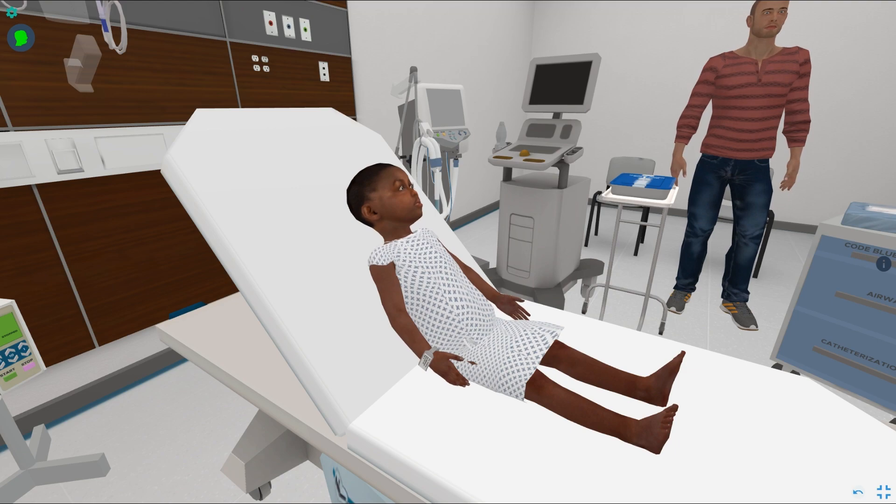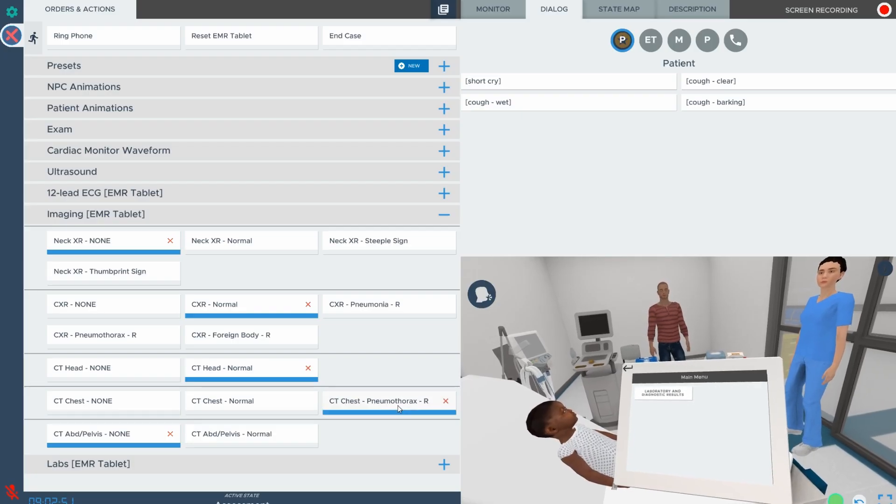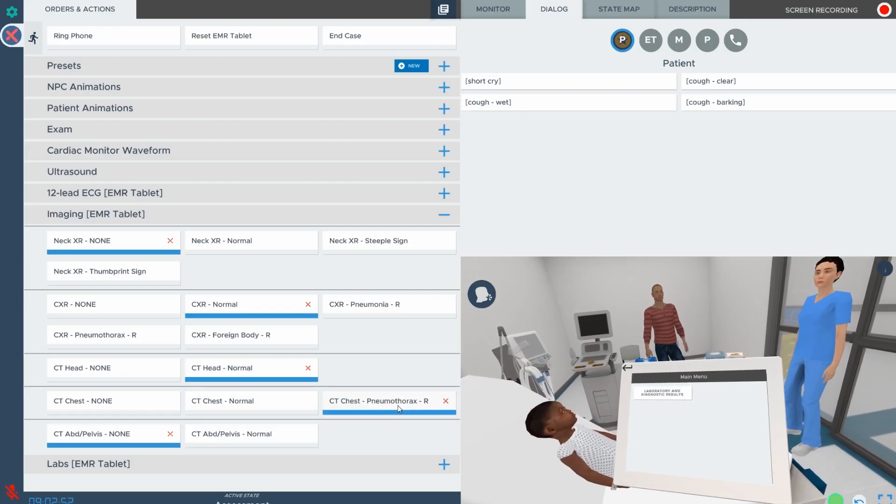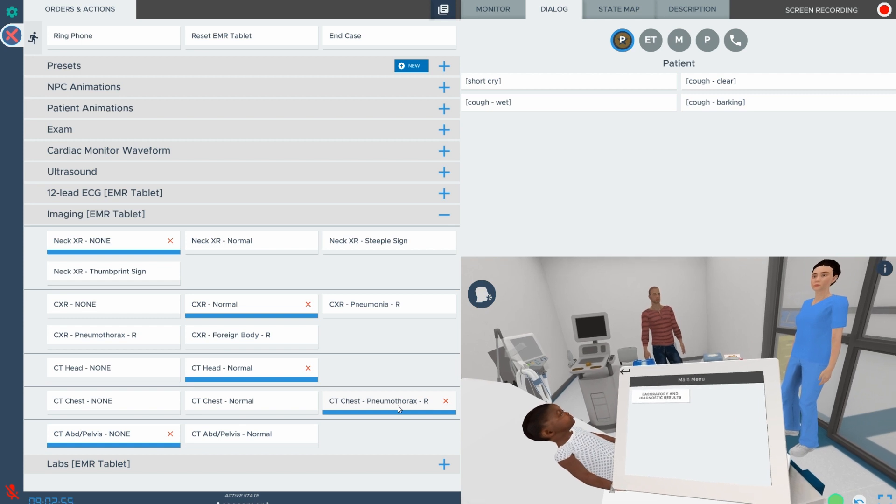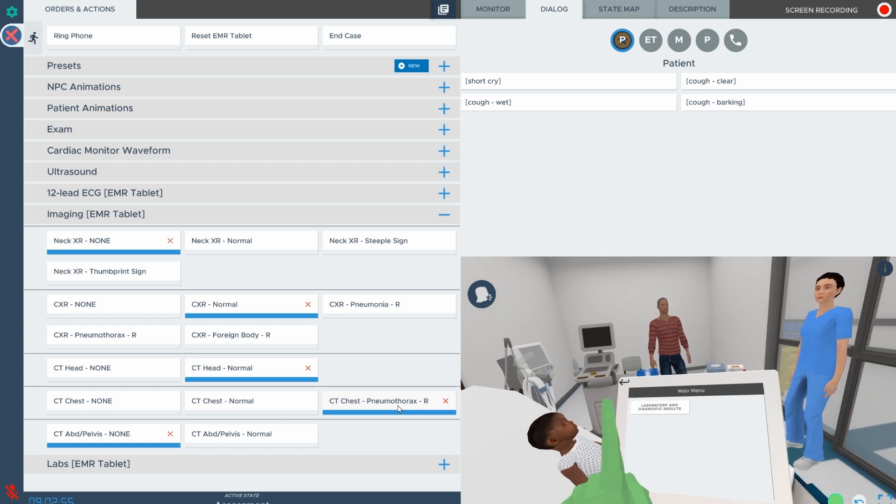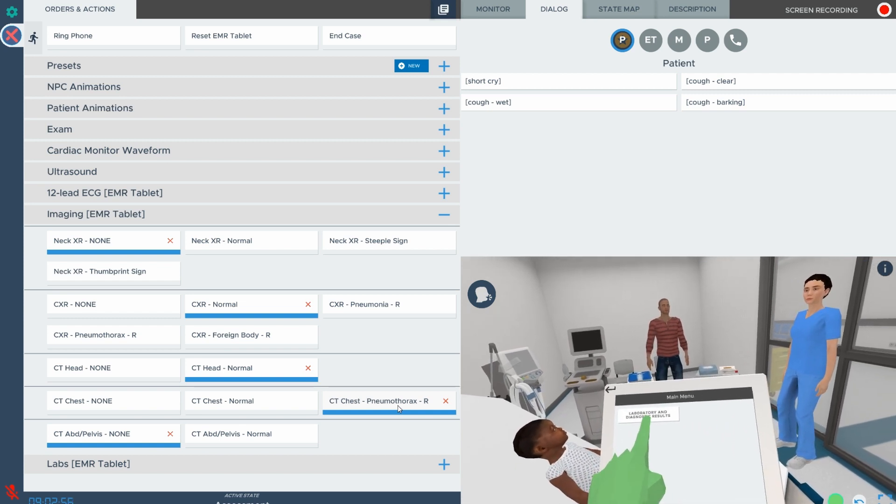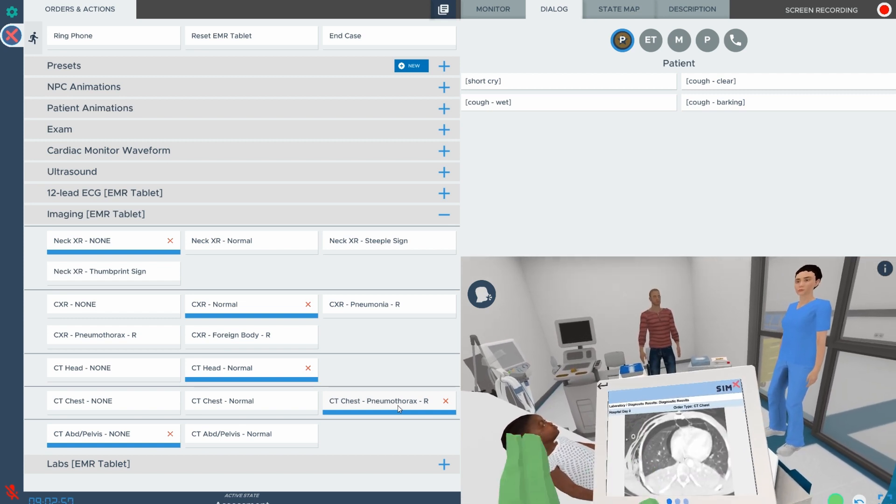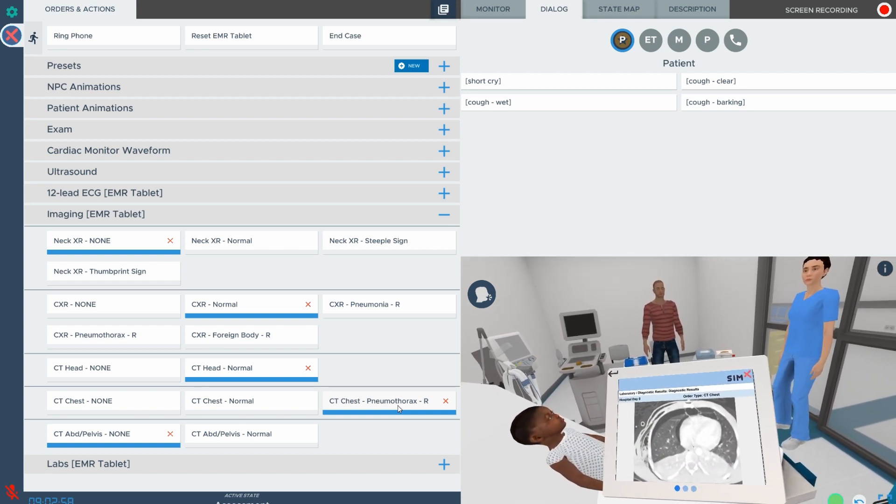Our interactive EMR tablet gives learners control of ordering tests and checking on results, instantly updating based on their direct input.